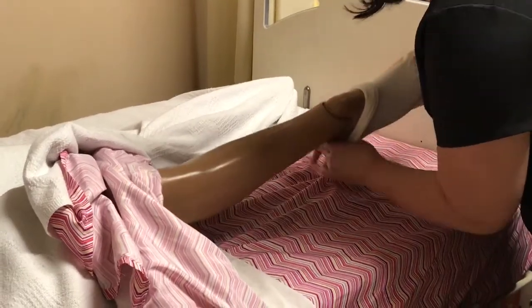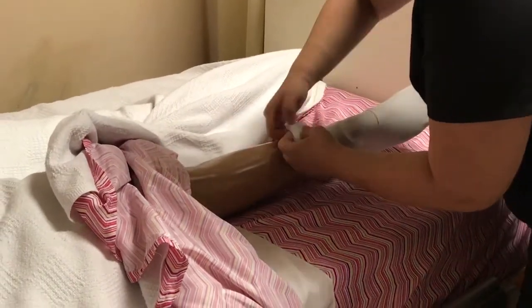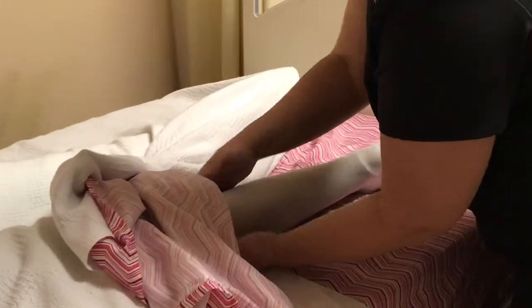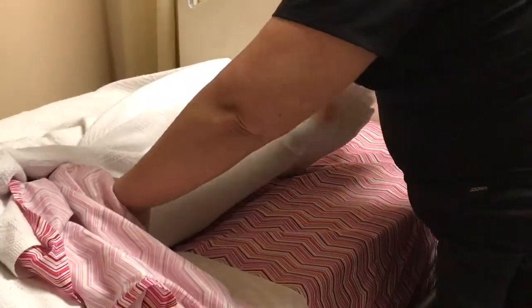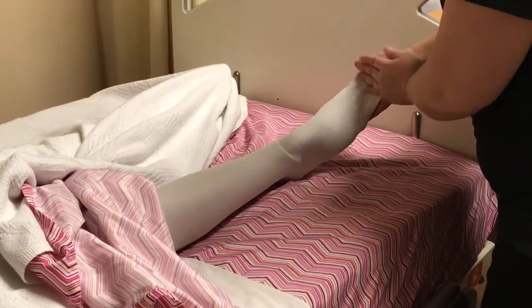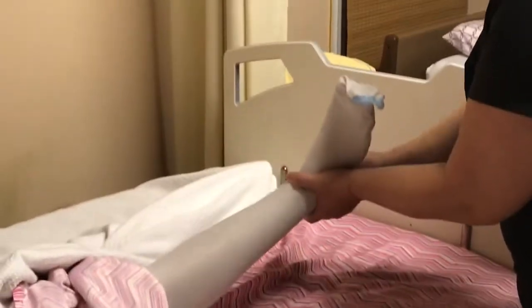Pull it up over your heel and the rest of your leg, not using any force or bending your joint unnaturally. When the stocking is on, we're going to make sure that there are no twists or wrinkles in the stocking and that the toes are not coming out of the hole, but the toe is at the hole area and the heel of your stocking is on the square.